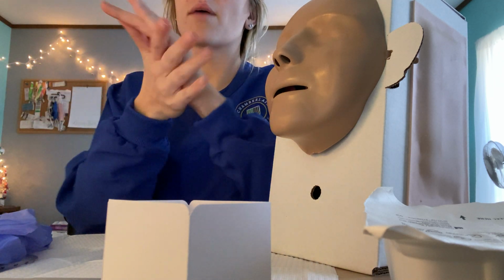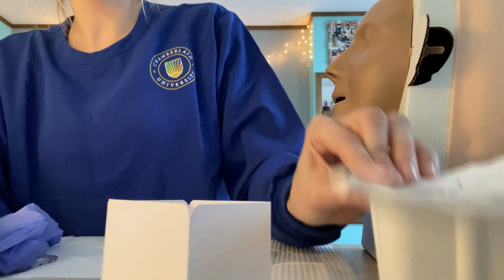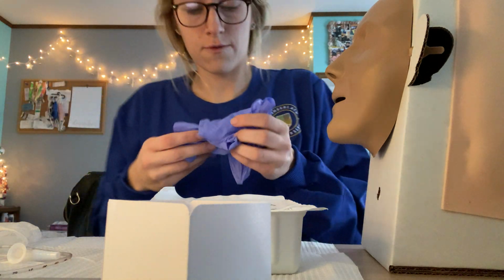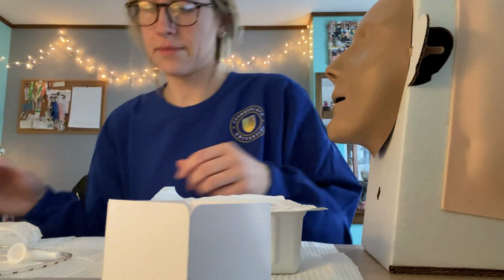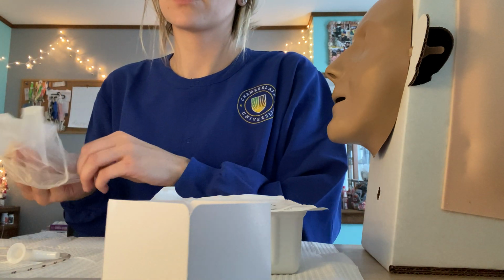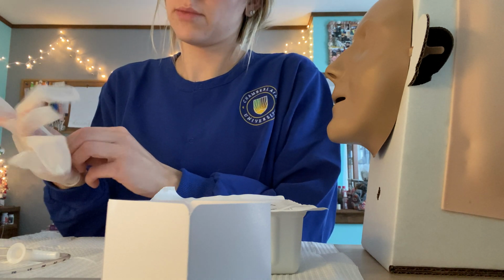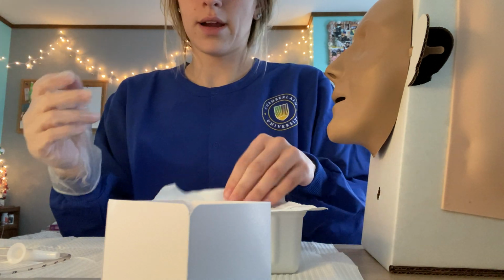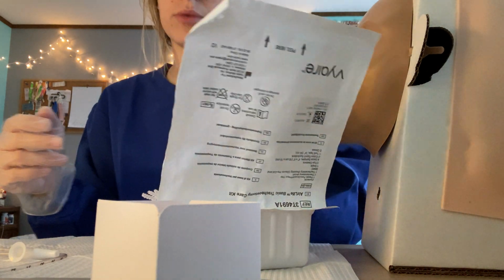Okay, and now I'm going to open up my trach care kit. So here's my trach care kit. And then for this, you only have to don 1 sterile glove this time. So putting my 1 sterile glove on. And I didn't touch that, but it's hard to get them on after putting the trach on. All right. I have my pre-moistened cotton tip.